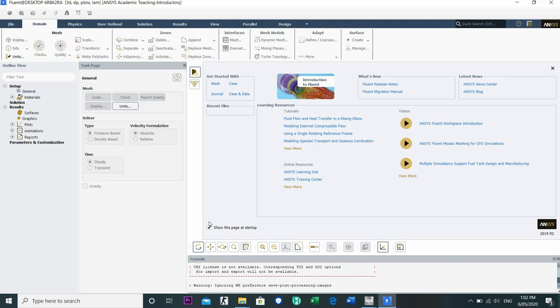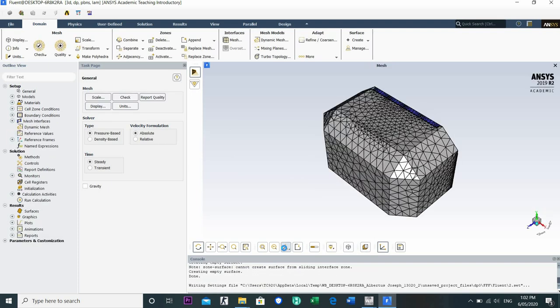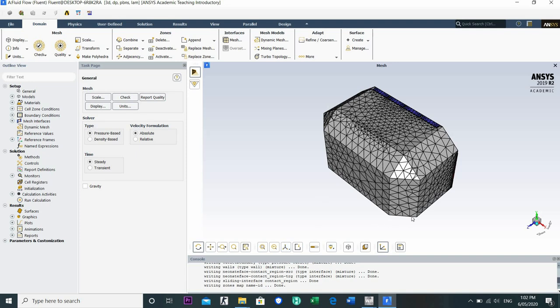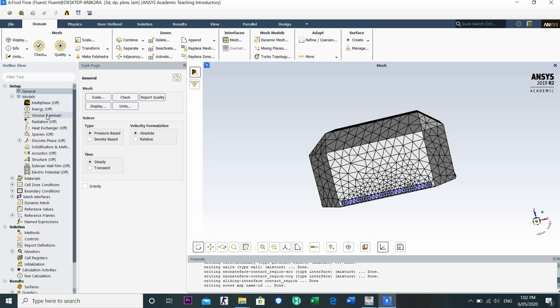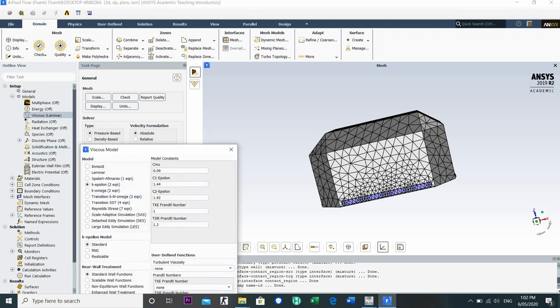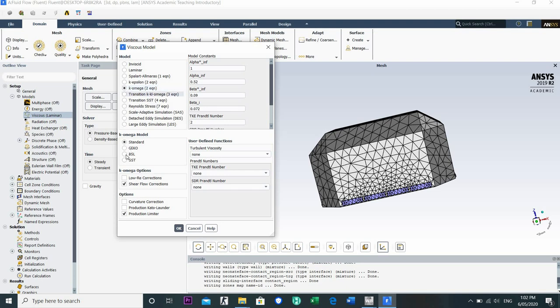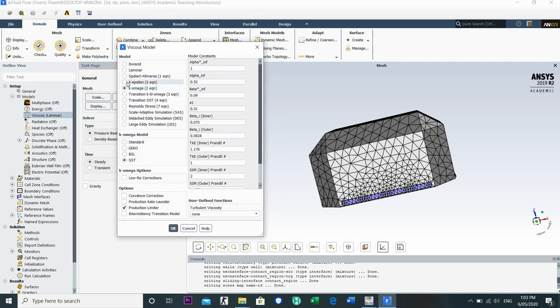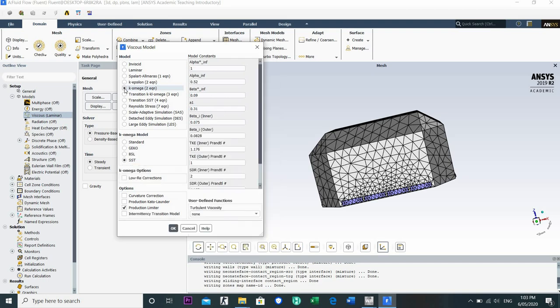Okay, it sounds like it's normal. I hope that it's going to open the mesh pretty well. Okay, there's no problem here. And then as we can see here, we are going to set it at steady rather than transient, because steady takes better time efficiency. And then we are going to the viscous model. Actually, you can go to the k-epsilon for the standard or RNG, or k-omega for the SST. I'm using k-omega, but it would be right if you are using k-epsilon and RNG. It doesn't affect a lot in the simulation.